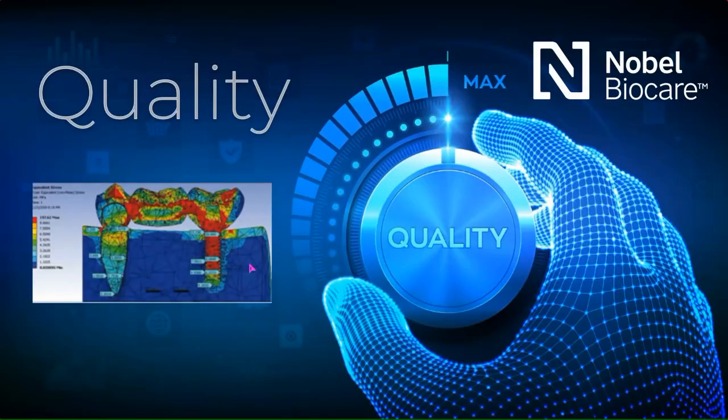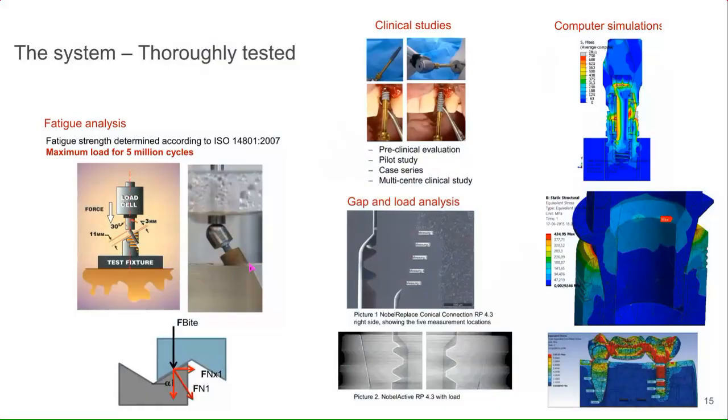Just to touch on our quality with our NobelProcera restorations, it is a very, very important aspect of what we do at Nobel Biocare, specifically with NobelProcera. Our products are very thoroughly tested, whether it's fatigue analysis, studies, computer simulations, load gap analysis. We never will release a product onto the market without this full validation of studies and testing and science. And of course, that will be for all of our NobelProcera implant bridges, and they go through strict testing.